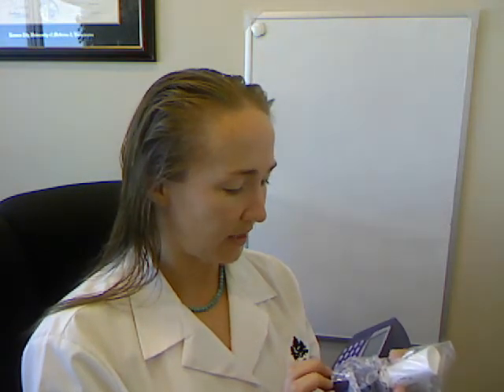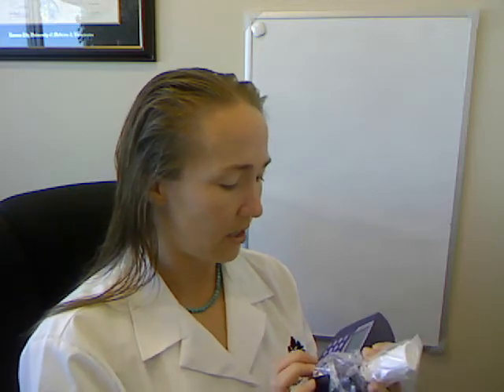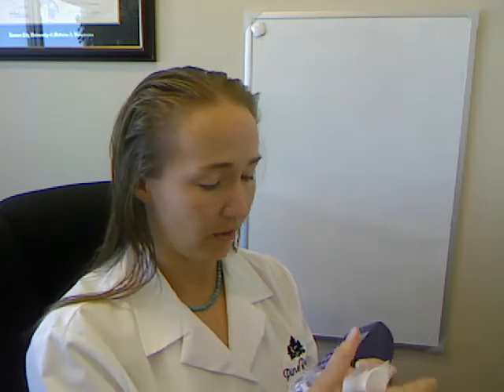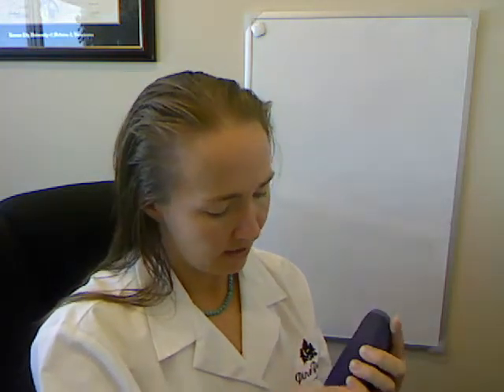Okay, so that's all blocked. Please check correct insertion. Okay. It's setting the baseline, so we need to avoid it going in through. Goes to show doctors don't always know how to set this up right. Oh, I bet that matters. There we go. I inserted it wrong. Sorry. Okay, then I block the flow with the plastic bag. There, now I've done it right. Setting the baseline.